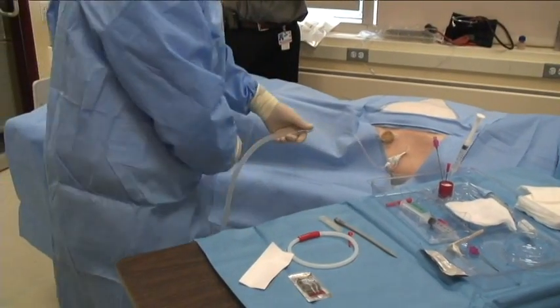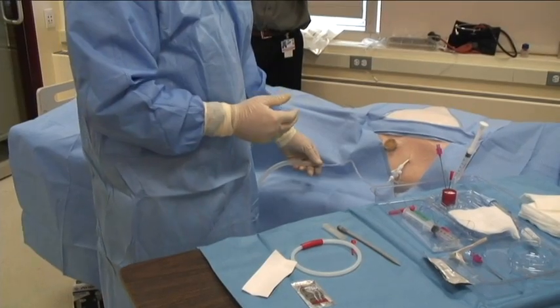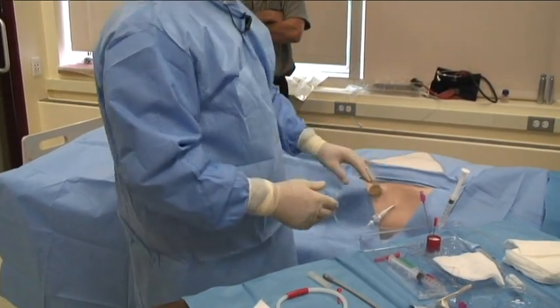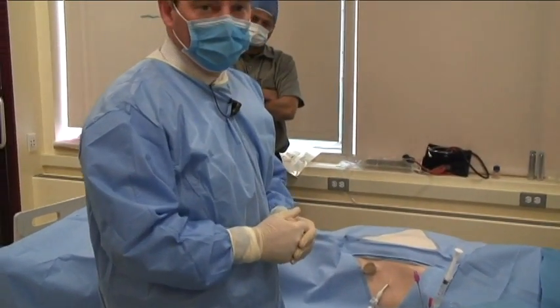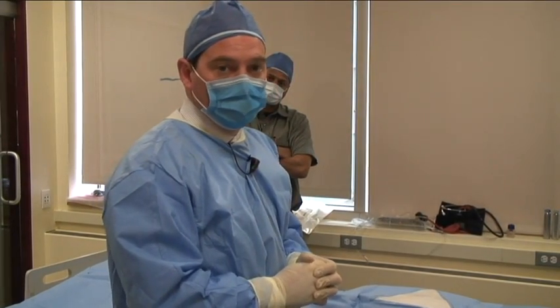So make sure you have adequate room on your hoses and tubes so that you don't actually pull the catheter and put traction on. It can be painful to the patient and may actually dislodge your catheter. When the procedure is done, sterile dressings can be removed. Of course, like I mentioned, we have a sterile bandage on here, and the patient will then have a chest x-ray to evaluate tube position as well as any complications.